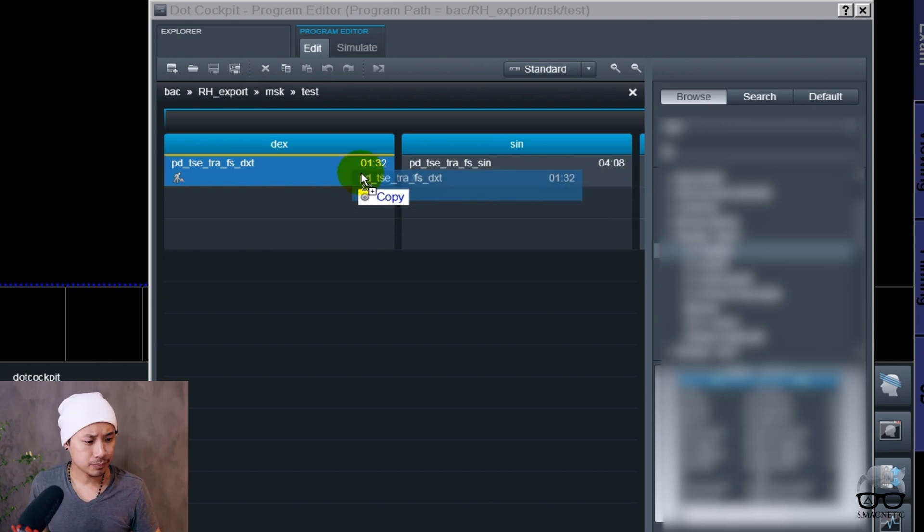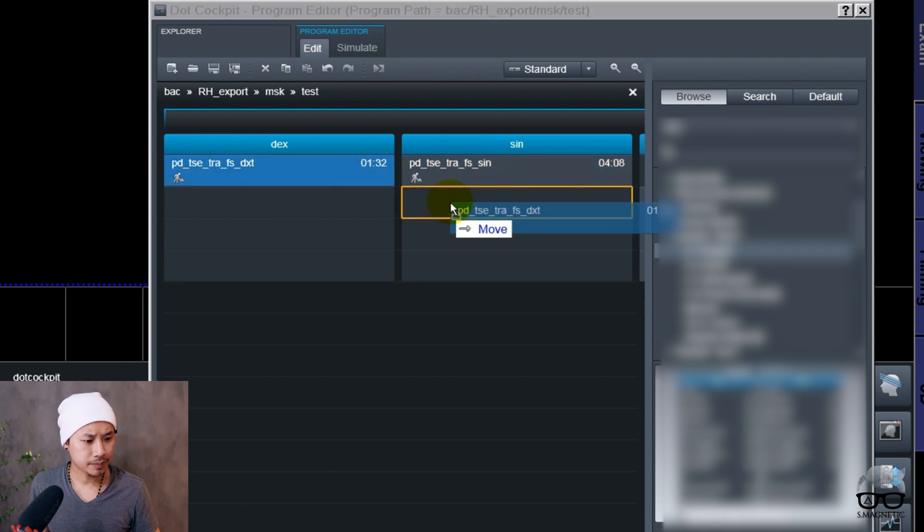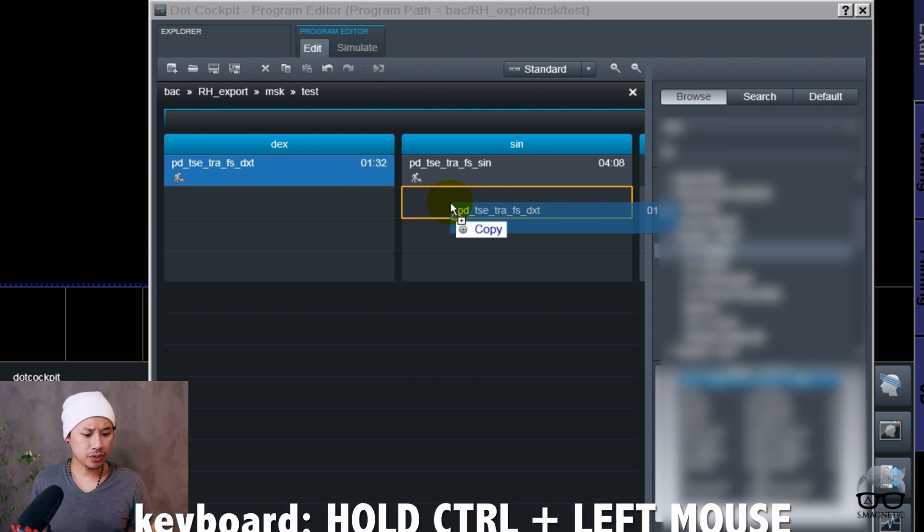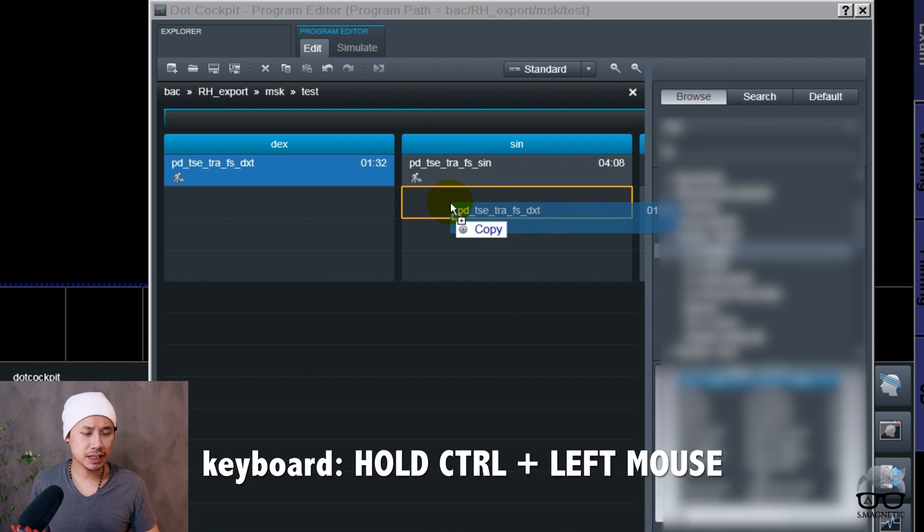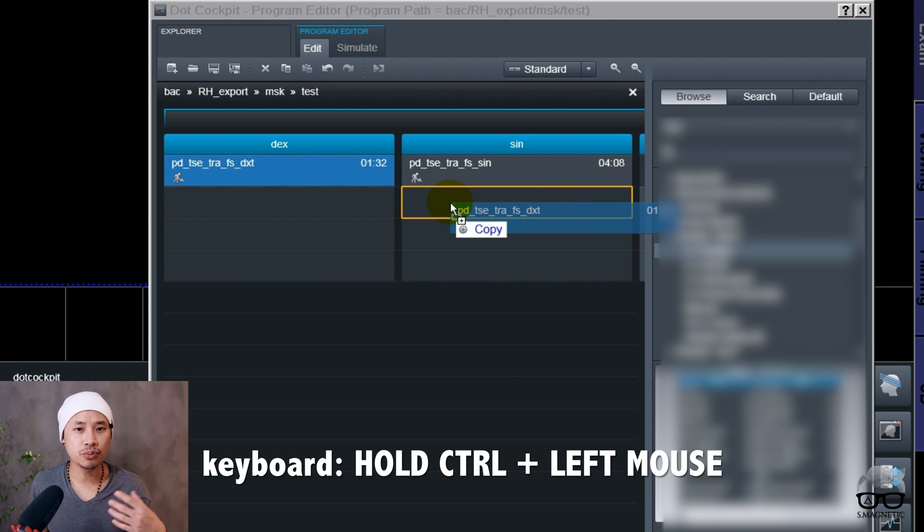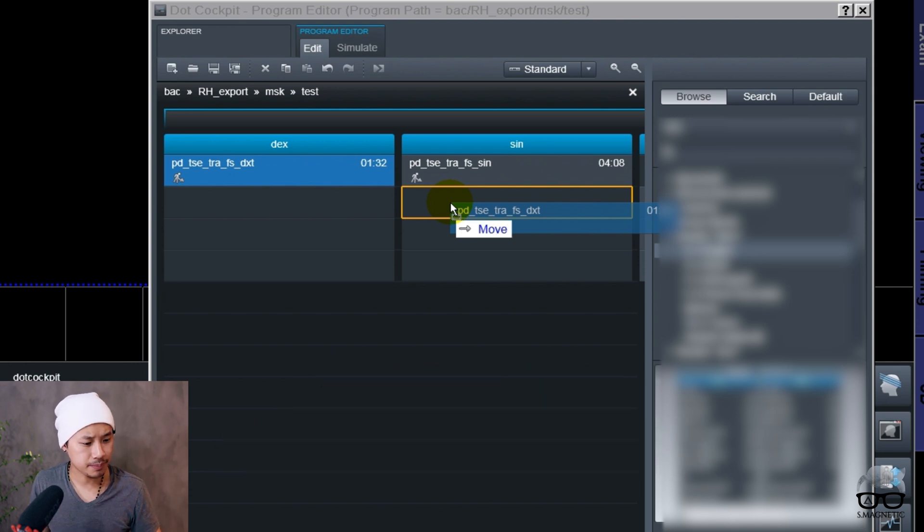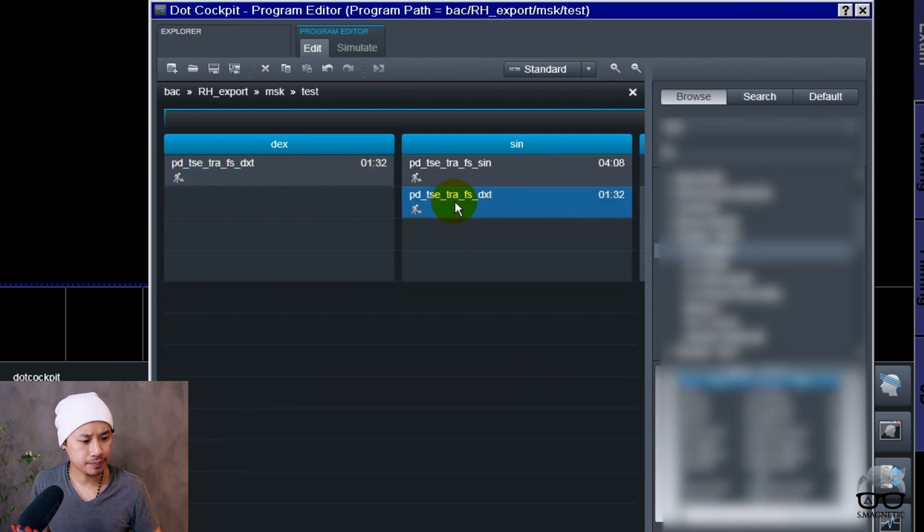You see here the move copy. If you hold the Control button, then you will copy the sequence and won't lose it. But if you only drag and drop, then you move your sequence. So the Control button with the left mouse click.